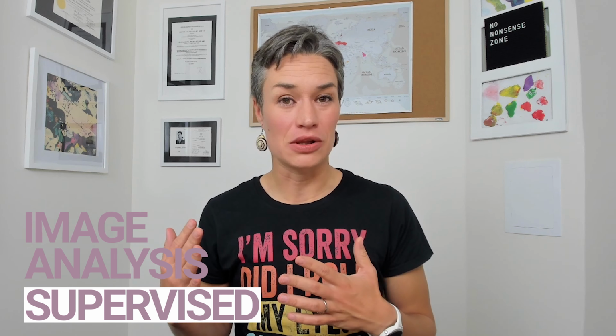In this video, you will learn how a practicing pathologist created a supervised image analysis model that actually predicted clinical outcome. A pathologist is not a computer scientist. We do not code, or most of us do not, but you will see what tool our guests use and how you can use it too.